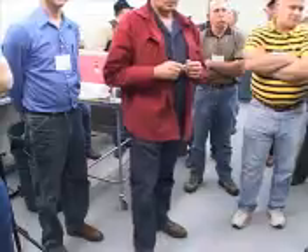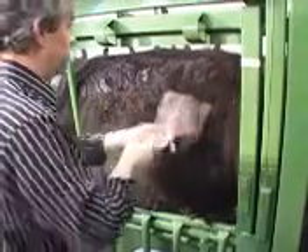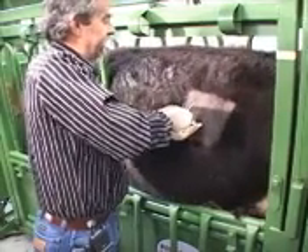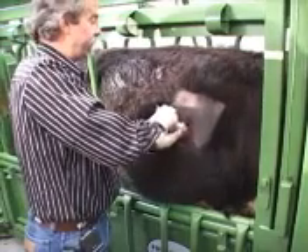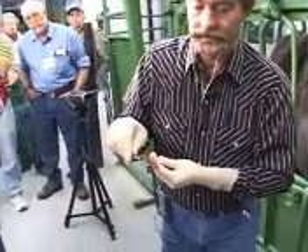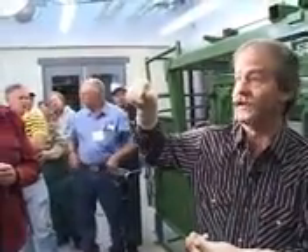I generally ask that everybody tries to get me two true cuts. I don't need to do any further prep — everything is still clean, everything is still sterile. I have touched nothing with the needle that wasn't sterile. So I'll just come right back to this same spot, come right back between the ribs. Since I know that this animal's liver is in that position because I got a good biopsy the first time. It is a very, very simple procedure.